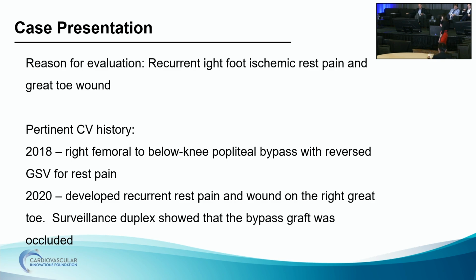And then what you use for the surgical revision depends on the patient. Like if they have a more saphenous vein, like contralateral saphenous vein, I would use that to do an interposition graft after you've tried to balloon angioplasty the stenosis a couple of times.